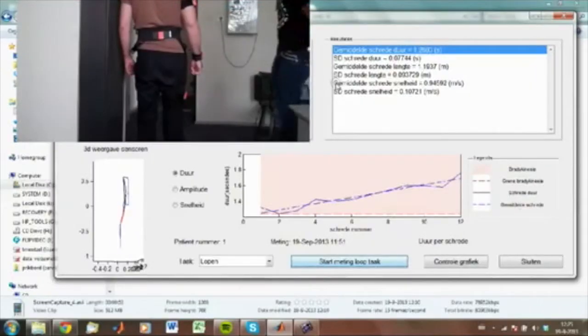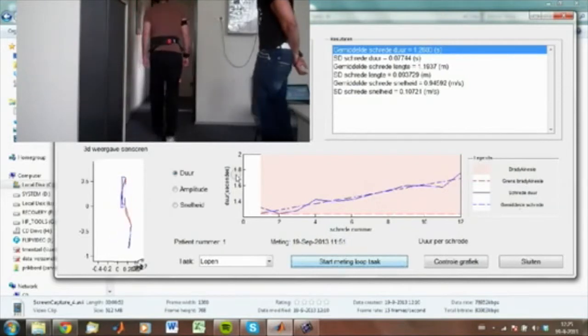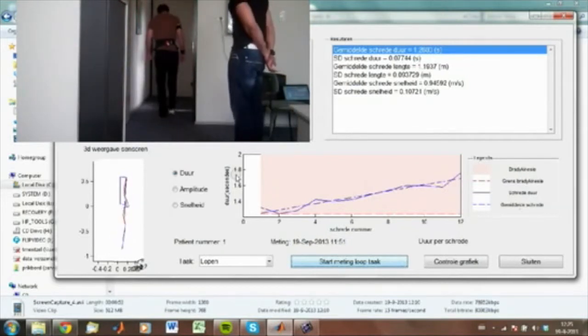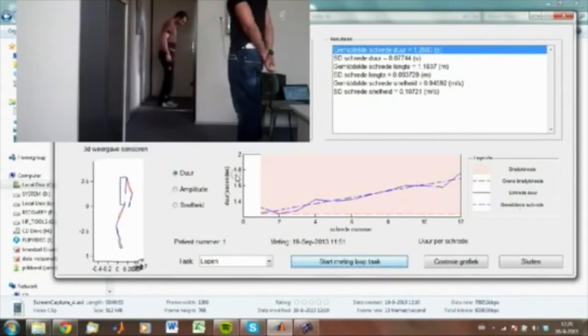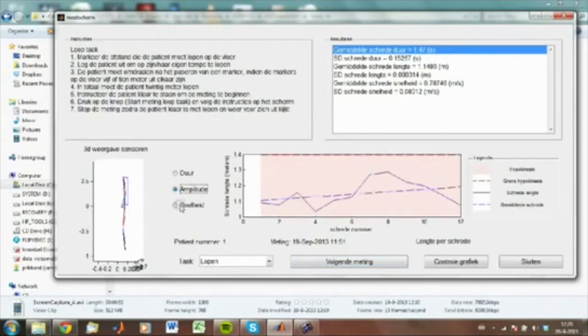The last task is walking for 20 meters at normal pace, best done in a corridor. On the monitor you can see the walking. We obtain the duration, amplitude, and speed.